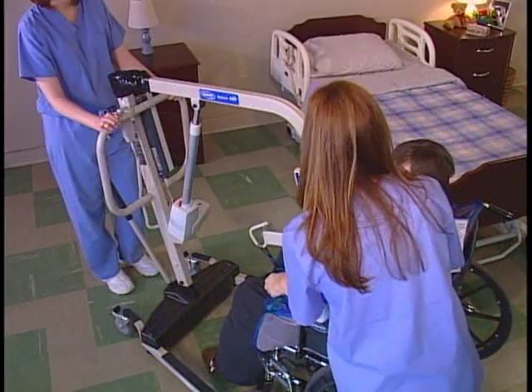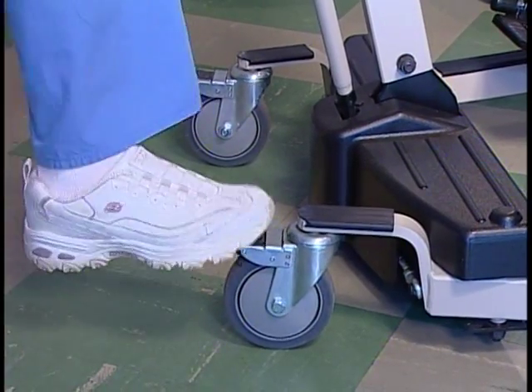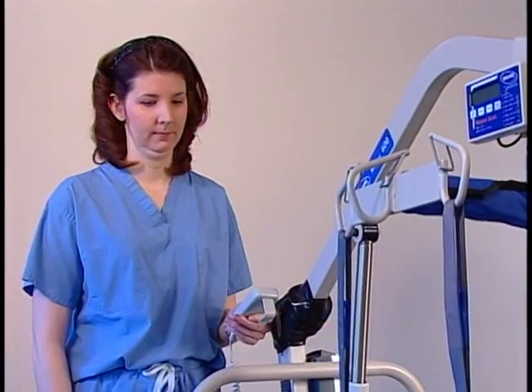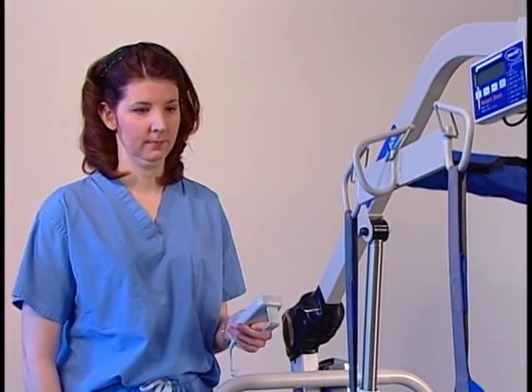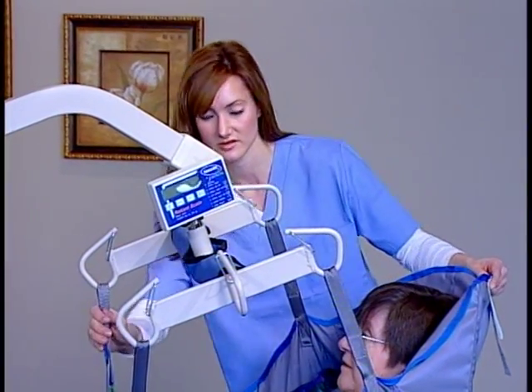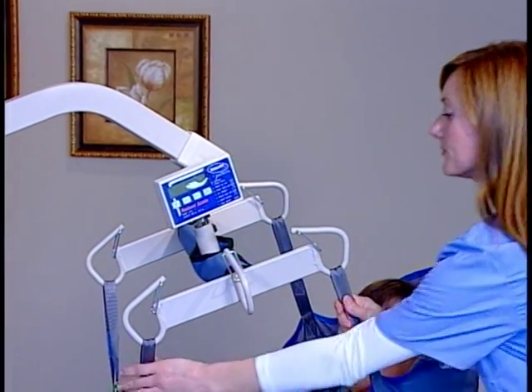Make sure the resident's arms are inside the sling. Unlock the rear casters. Press the up button on the hand pendant to elevate the swivel bar and put a slight amount of tension on the sling. Double check to make sure that all sling straps are properly attached to the swivel bar. If they are not, lower the sling and fix them.